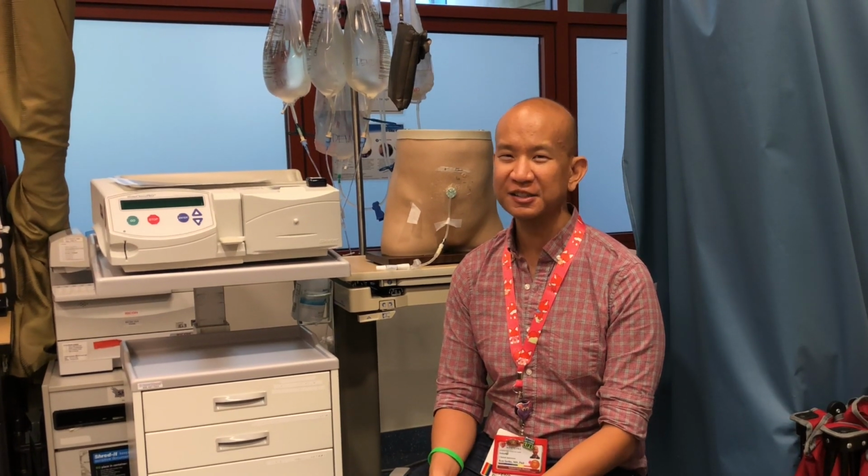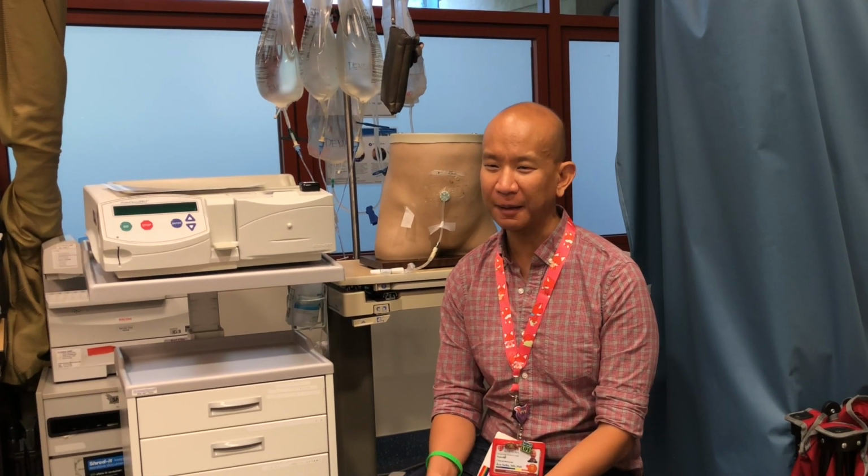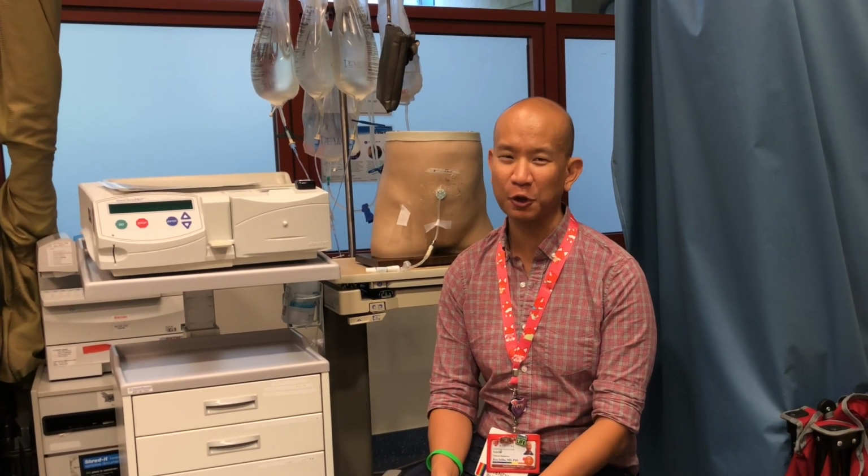We try to prevent against this by making sure that the family members that are helping to set up the peritoneal dialysis are well trained in looking out for the signs of peritonitis, but sometimes it can take a while for those signs to develop. And even with the best technique and sterile technique that they're observing, episodes of peritonitis can still happen.